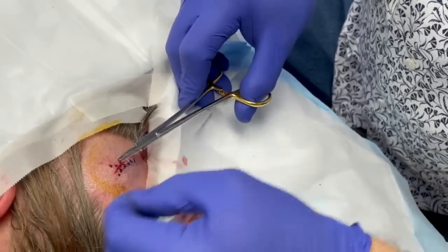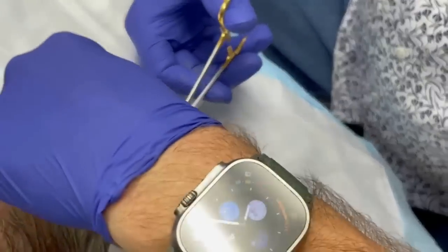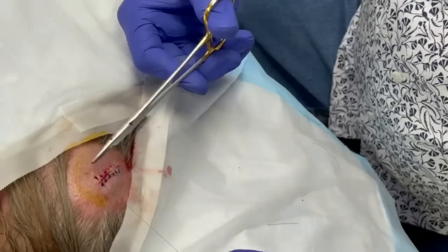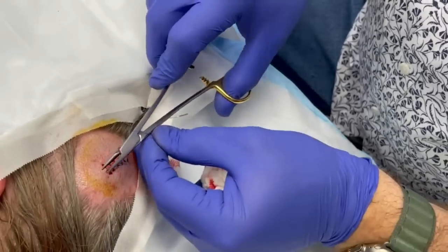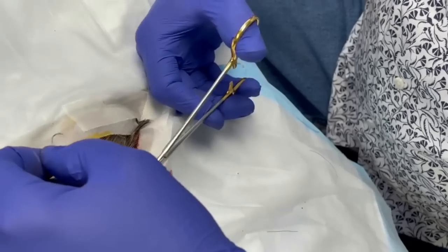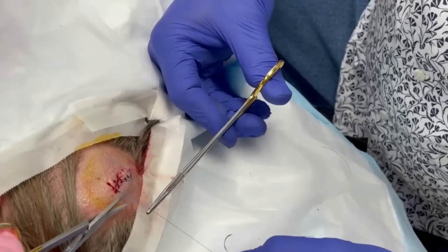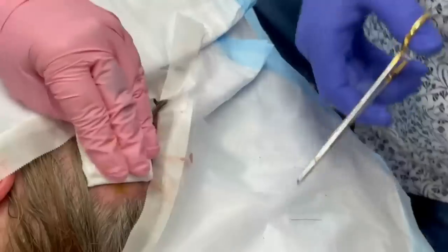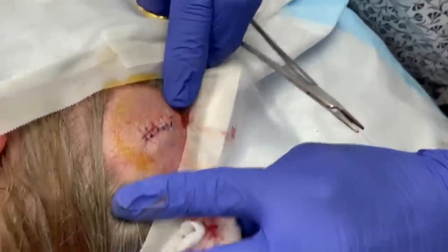Down to a little bitty amount of suture left. Yes, and I could always open another one, but I don't think we need to. There we are. Perfect. Let's snip that. If I can grab it. There we go, right there. Now we have a decision. Do we need to add one more in there? No, I think we're fine. What do you think, Jenny? Is that looking good? Yeah.